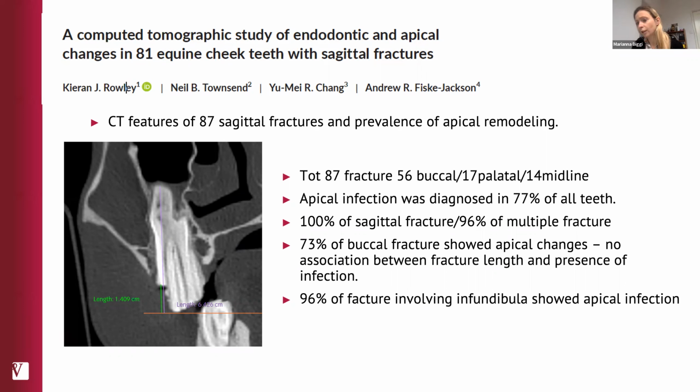Of course, these are very difficult to evaluate radiologically, but if you do want to see the extent of the fracture radiologically, then open mouth oblique views that are shallow in angle are quite useful for evaluation of the clinical crown.